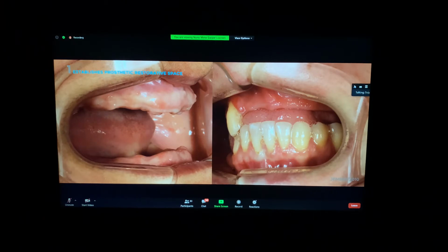Đầu tiên, chúng ta phải nói đến phần phải thiết lập đủ khoảng để phục hình. If you have a case like this, maybe we don't need to do. But on a case like this, maybe you must. Ở ca bên trái thì chúng ta sẽ không cần, nhưng đối với hình bên phải thì chúng ta sẽ cần mài chỉnh xương để thiết lập đủ khoảng để phục hình.